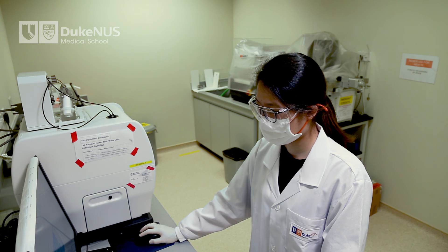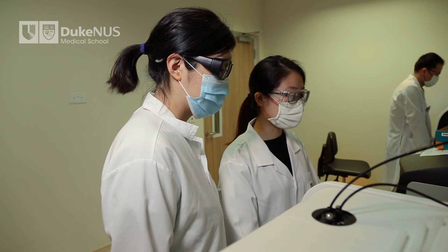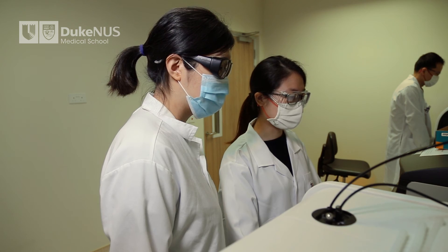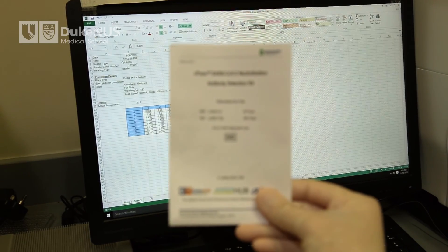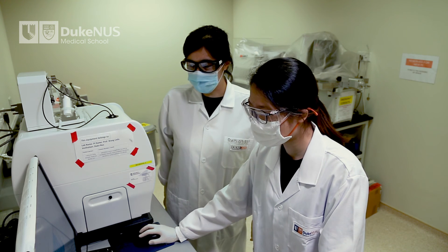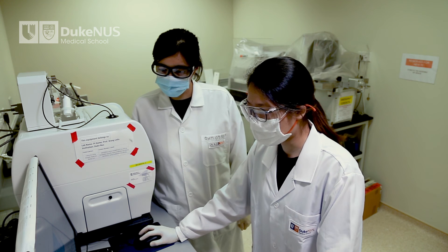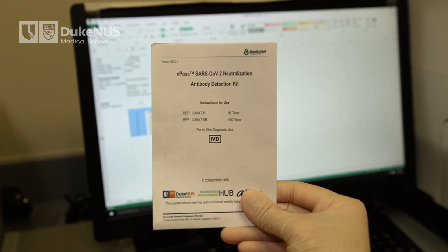This concludes the instructional video for cPass, the SARS-CoV-2 Neutralization Antibody Detection Kit. We encourage all users to read the instruction manual before use. Should you have further queries, please consult with the manufacturer — their contact information can be found in the instruction manual.